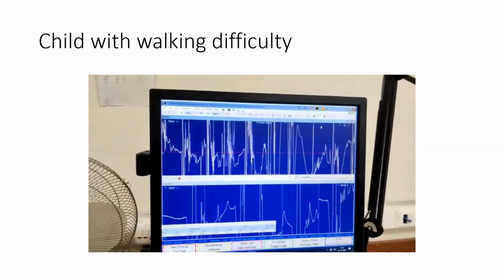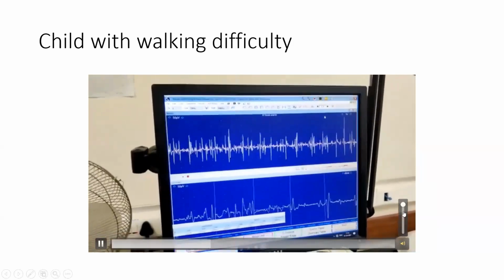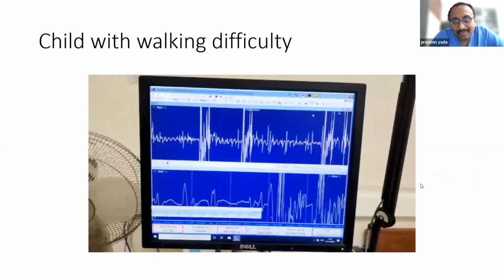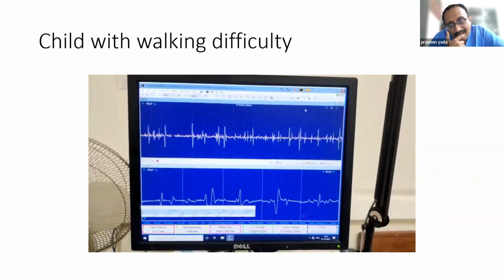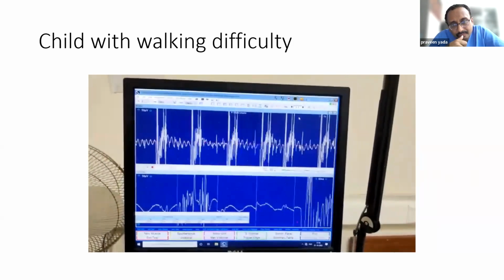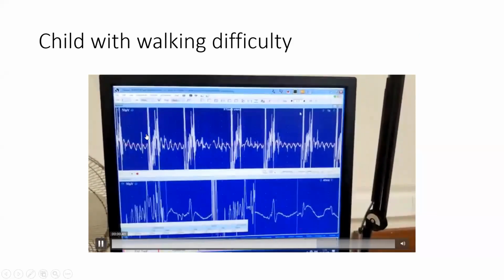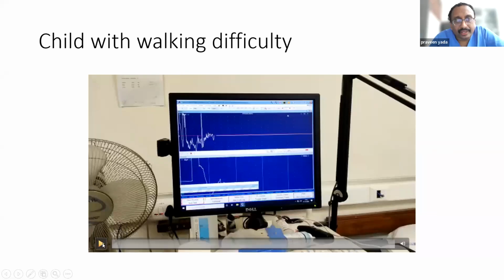Yeah, Dr. Anusha, you can. I'm not able to hear, sir. You can see them, and try to. This is spontaneous activity, by the way. Fifth, sir. One second. What did you say? Fibrillation, sir. Yeah. What is more evident? Just look at it and tell me.